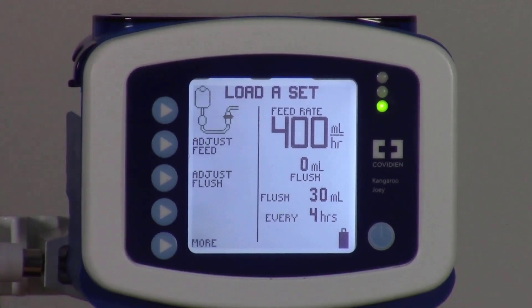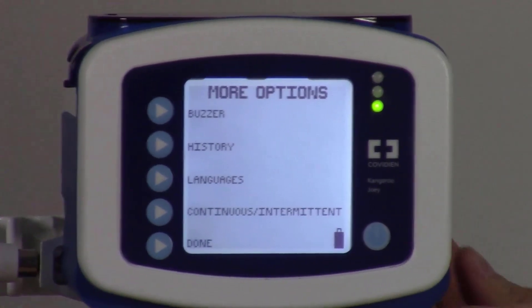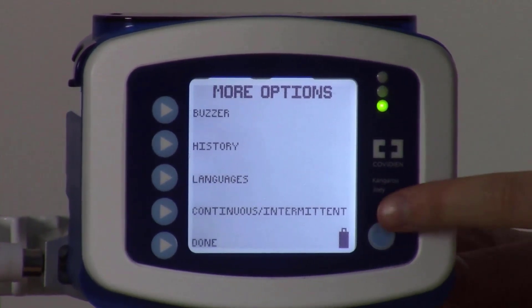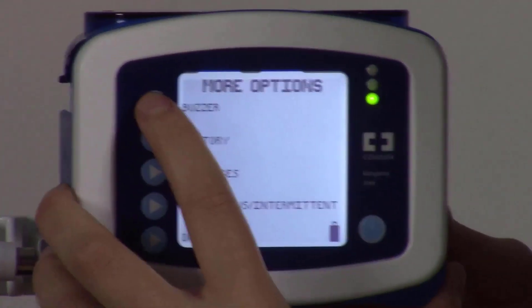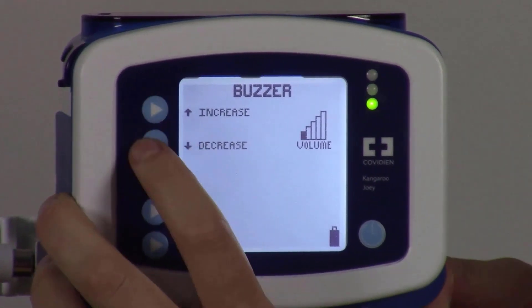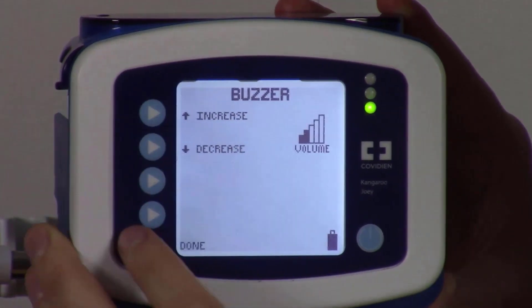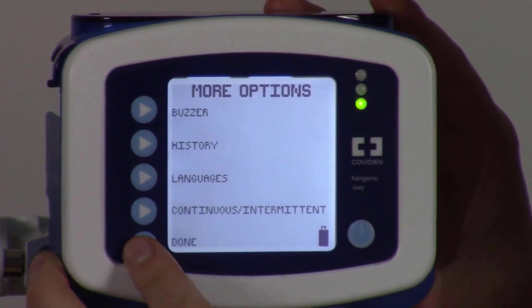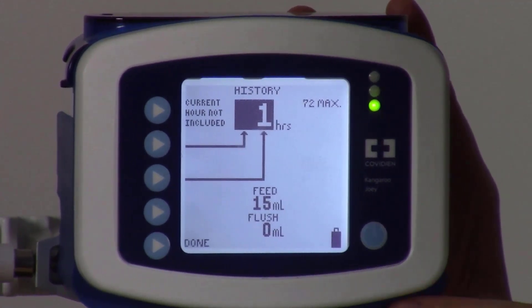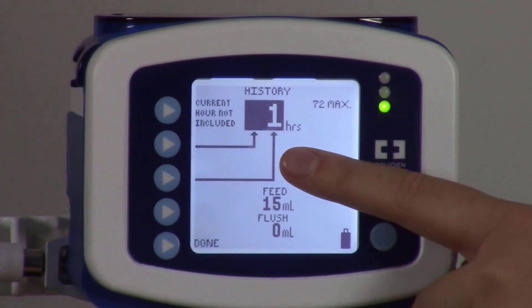To use the additional pump features, press the More button at the bottom of the screen. On the More Options screen you will see: Buzzer, History, Languages, Continuous, Intermittent, and Done. On the Buzzer screen, you can select increased for louder volume or decreased for lower volume; press Done when you have your desired volume. In History, you can see how much formula has been infused — set to one hour by default but changeable up to 72 hours.